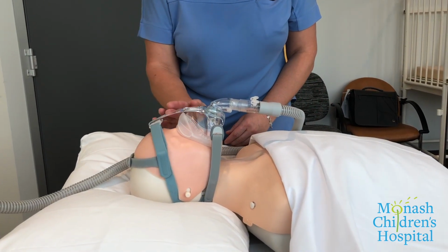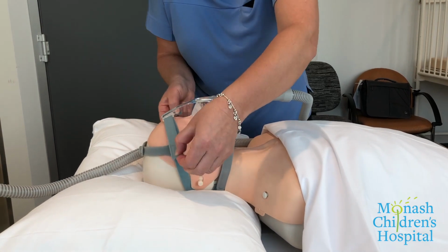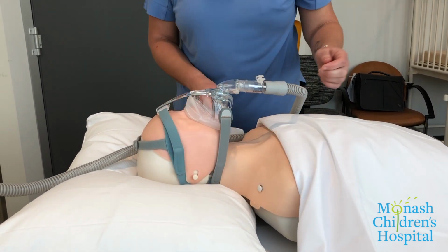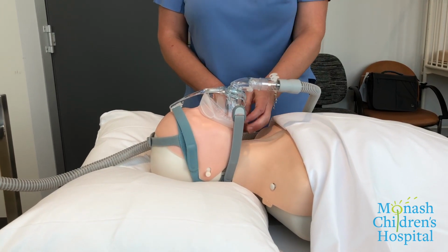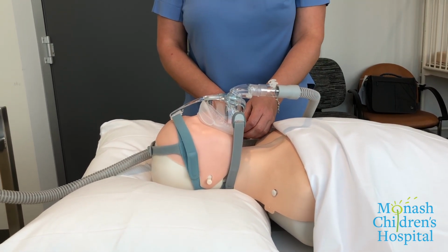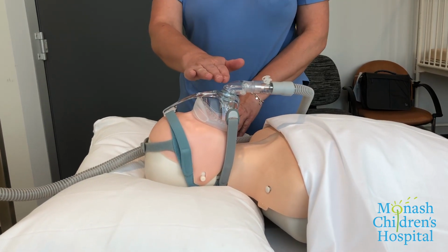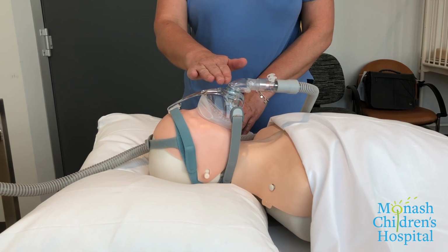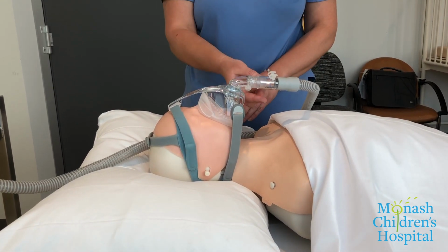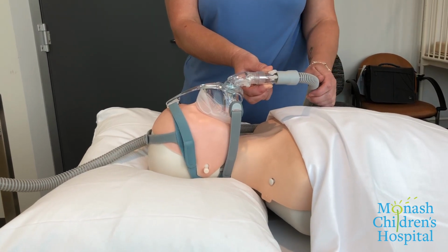Check for leaks around the mask, particularly around the eyes. Make minor adjustments to mask fit as needed by adjusting the straps on both sides at the same time so that the mask stays central on the face. Some leak doesn't affect the efficacy of treatment, but it is preferable that if leak is unavoidable, it is coming from the bottom of the mask. You will feel air leak from the exhalation port or holes in the mask. This is normal and required to clear CO2. If oxygen is not required, the oxygen port should be capped.